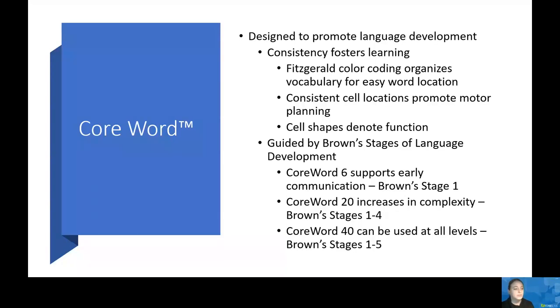With Core Word 20, this is where we see AAC users beginning to build phrases and sentences. This is a five-by-four grid set that includes everything provided in Core Word 6 with additional features, and now supports Brown Stages 1 through 4. It has predictive linking that keeps the words you need right at your fingertips. There are also comments and descriptive concepts, as well as emergency and medical phrases, visual schedule templates, and ABC and QWERTY keyboards.